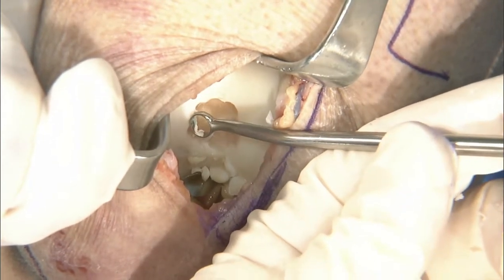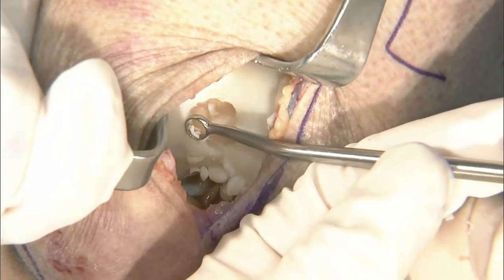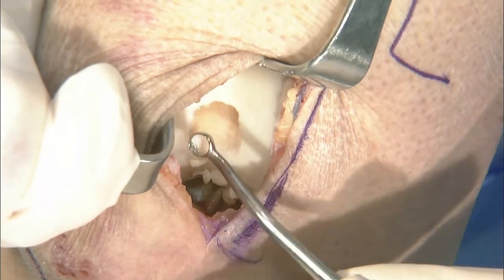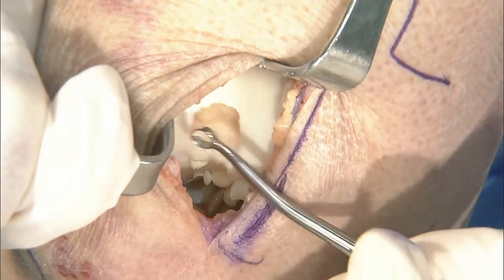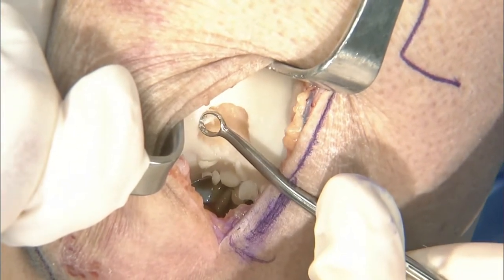Usually you can hear a little bit of a difference in the pitch change, and it's definitely something to work on in the lab to really see it start to go away. And if you're not sure you're doing it, again, go to a smaller curette, and then all of a sudden you'll start to see more coming down, and you'll get a much better idea. But it's certainly not that easy.